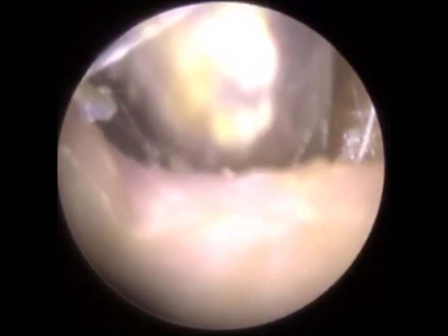Just behind this plug of dead skin, the firmer skin, you'll see it's very damp and moist, and that can happen with dead skin. It can eventually get very damp and wet, and that is obviously extremely humid. You can imagine it being completely blocked for many a year, and beyond the outer layer, the ear does become very damp and humid. So I'm going in with the standard suction probe here, just to vacuum some of that dampness. And at the top there, you can see a bit of bleeding.